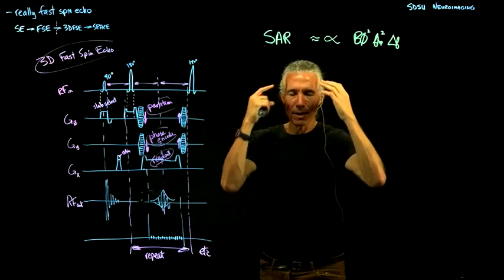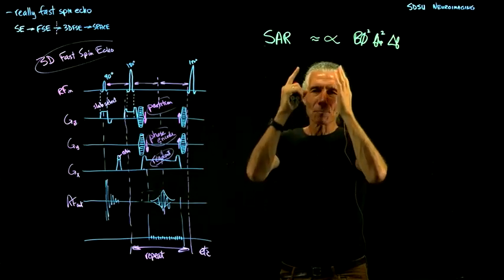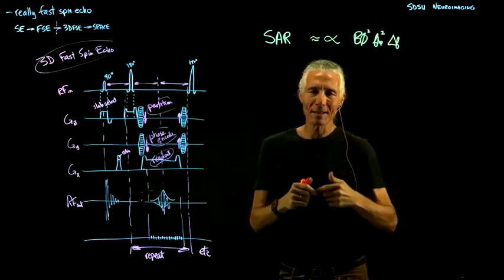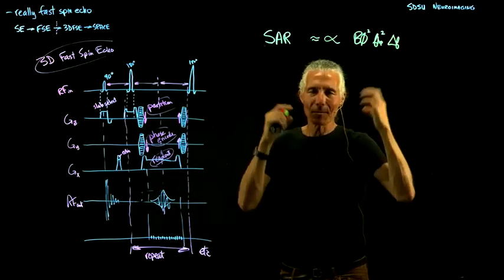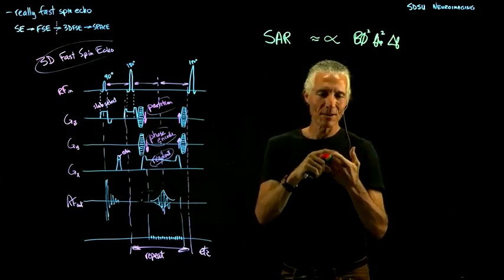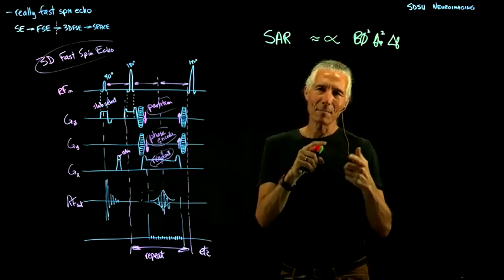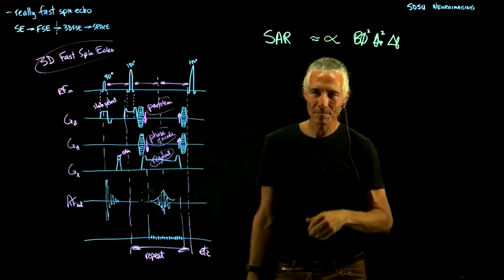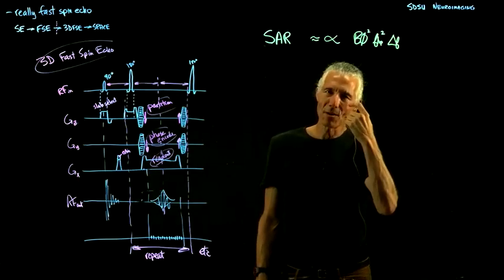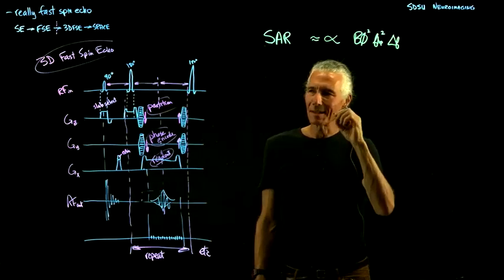And so for something like the brain, it's a particularly safe thing to scan because it's got a huge blood supply, because like 10 or 20% of your whole metabolism is just supporting the brain. And so if you heat up the brain a little bit, no problem, the blood's going in and out. It's like your finger, you have a good blood supply in your finger, and so if you heat up your finger, it will quickly get back to normal temperature because there's blood going through it. There's other things that are not so good, like the cornea is an example. The circulation in the cornea is much more slight than the circulation going through the brain.